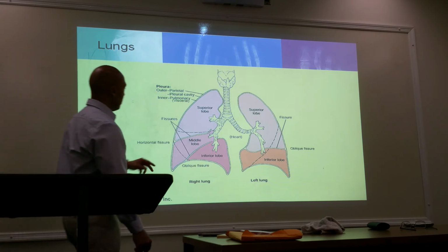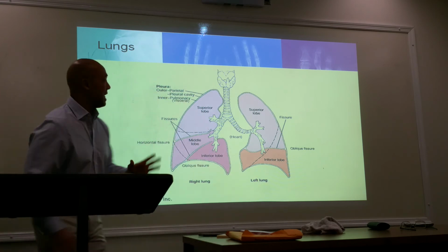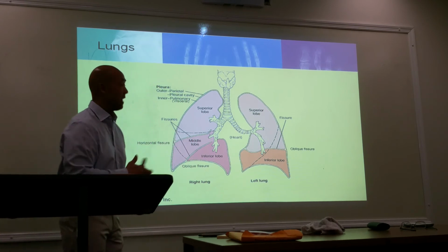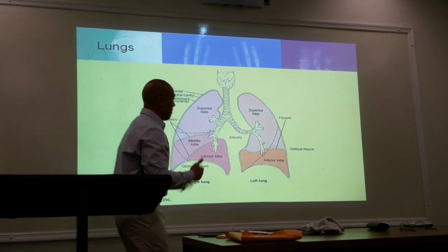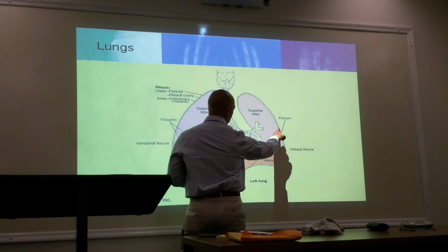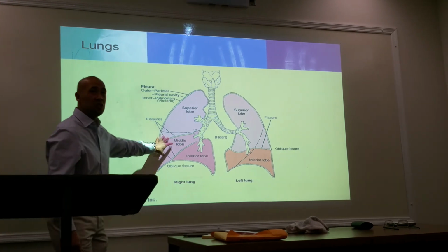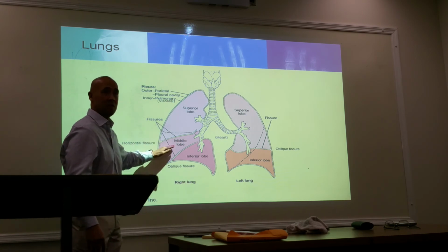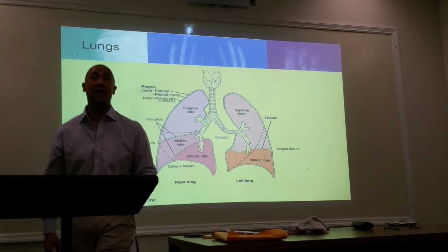Now you guys notice that there are these extra dotted lines here, right? These are also your fissures in a lateral view. So when you're placing your patient in a left lateral, you're going to see this line going down the lung. It almost looks like there's fluid in there. Because we're doing a left lateral, the left lung is going to be closest to the image receptor. So you're going to see a line coming down the lung, which is the oblique fissure of the left. You won't see the other fissures here normally because the right lung is going to be furthest away from the image receptor, so you won't see these fissures on a lateral chest x-ray. The one that you will see is this left oblique fissure on a left lateral chest.